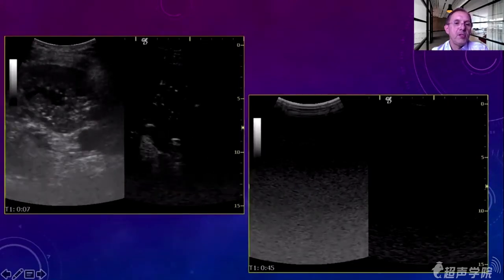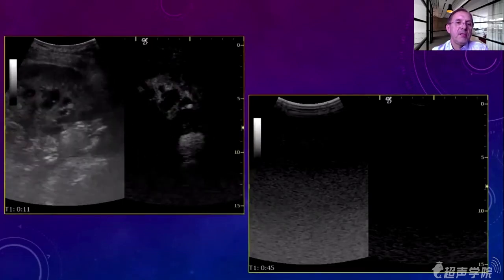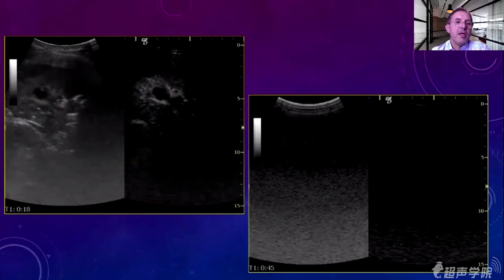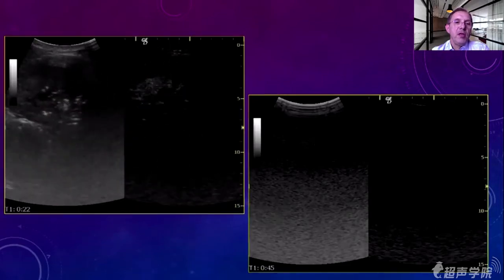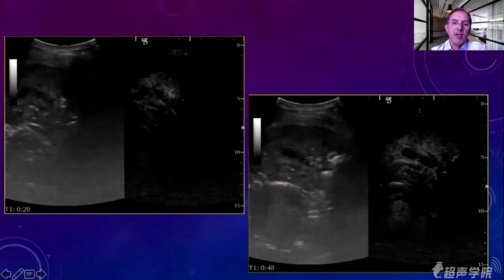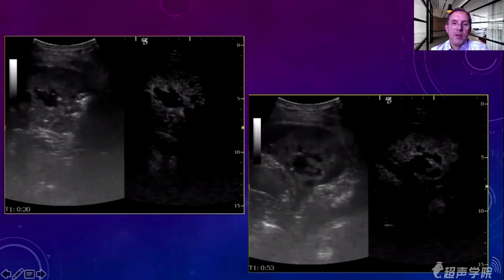But if you inject contrast, the tissue takes up contrast 7-8 seconds after the injection. So it was clearly pulmonary tissue, it was not a tumor, and you see very well the delineation of the dilated bronchi in a patient with bronchial disease.